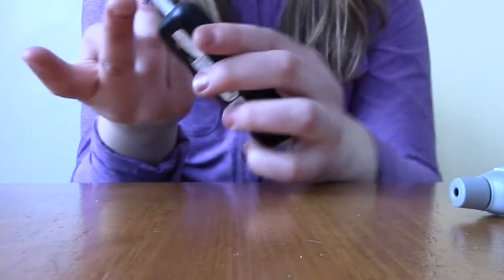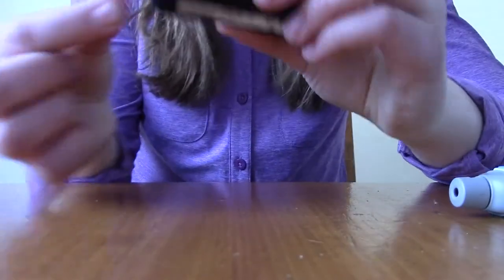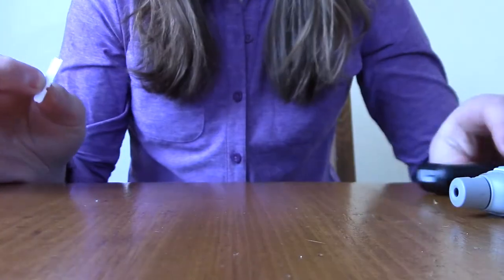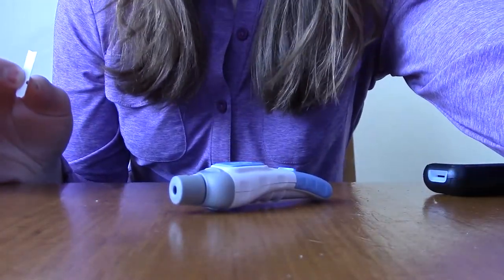Once you are done, all you have to do—I like to just wipe off the blood on the side of the strip—you just remove your strip and throw it in the garbage. And voila, you have checked your blood sugar levels! Hope that helped, guys.